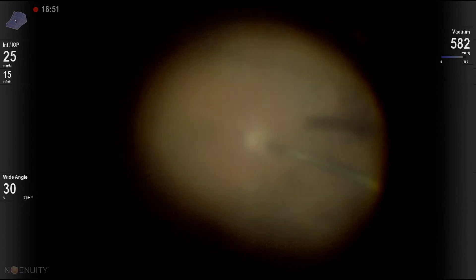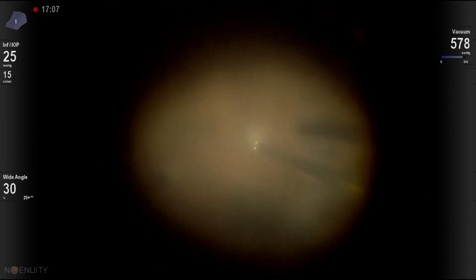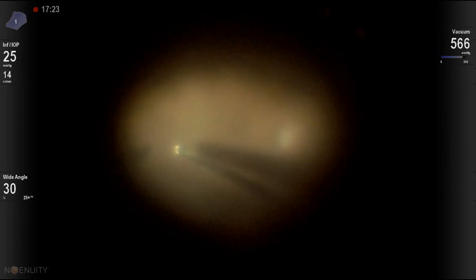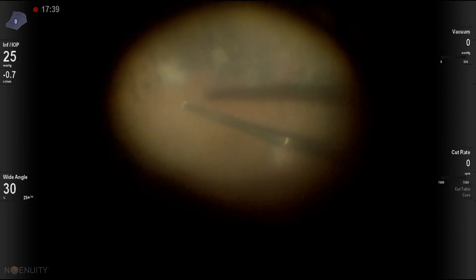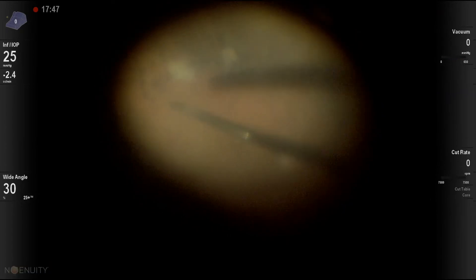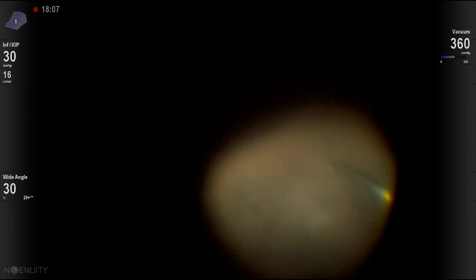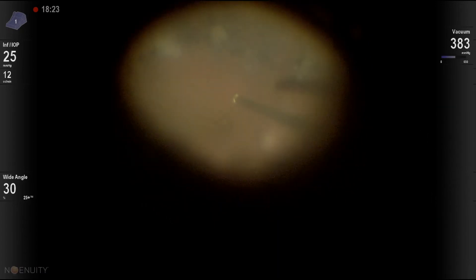This is the disc, the macula, and you can see some infiltrates peripherally. We're trying to cut near that infiltrate just to remove what we can, but you want to be very cautious because the retina can be friable. It doesn't look too bad here, but again, that's the guiding rule for endophthalmitis.